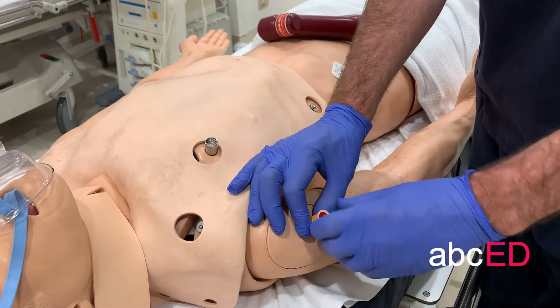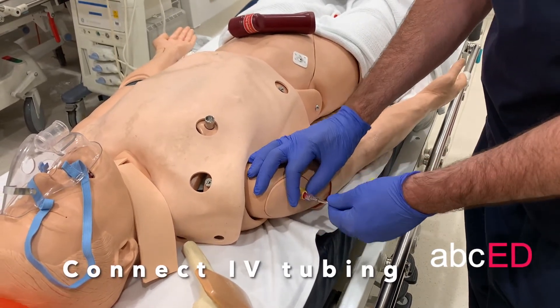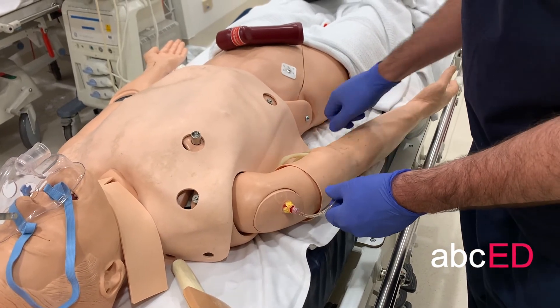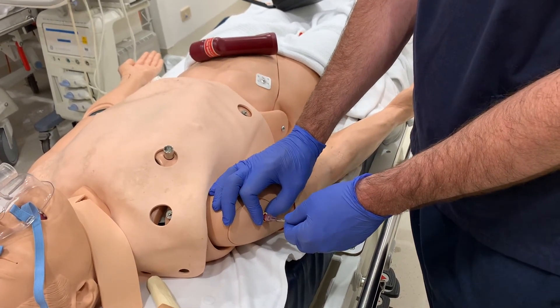Then you can remove the stylet. The connector is a luer lock connector — twist that on, you can aspirate, and then you can give drugs through there. Some kits will come with a triangular dressing that slides over to secure the IO in place.